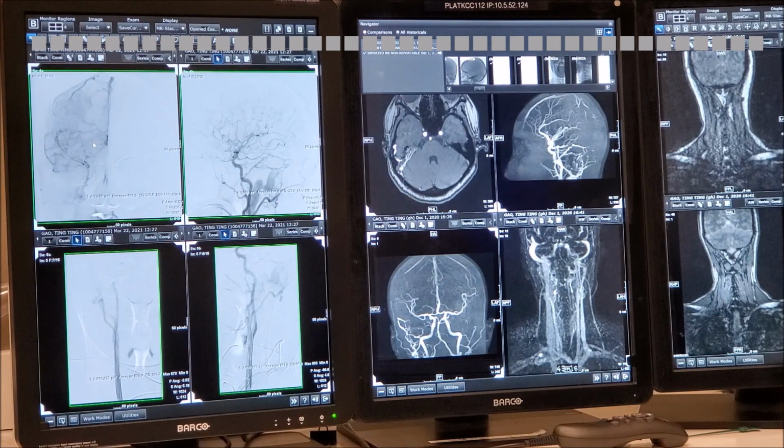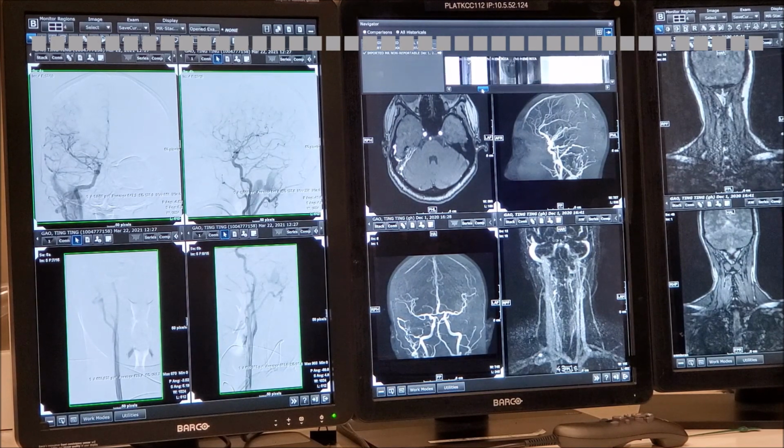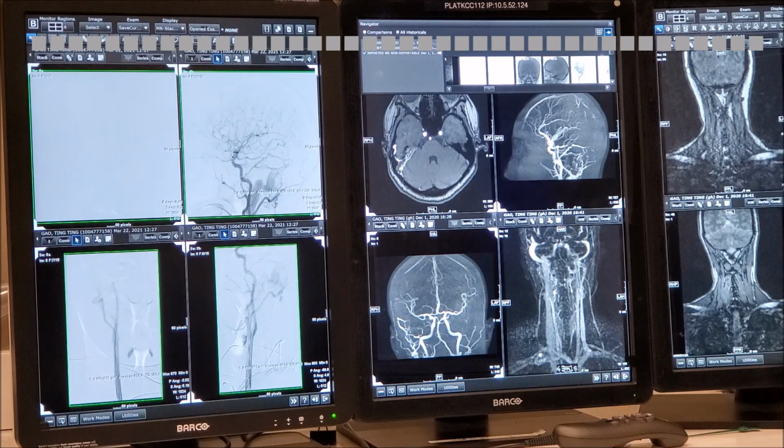But you didn't carry it well to the venous phase. I realized this is a wrong shot. The catheter tip was supposed to be in the external, but okay, I like that. You see, that's very helpful. So we repeat it, and you're still not happy. Now we do a better injection here.